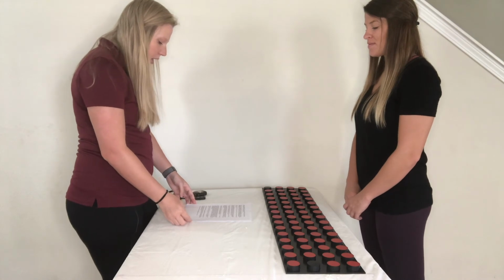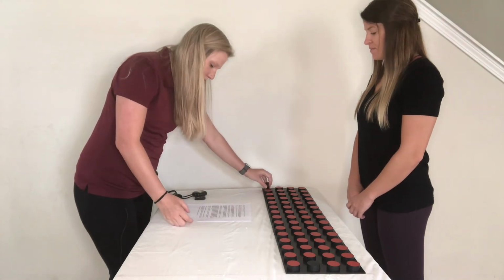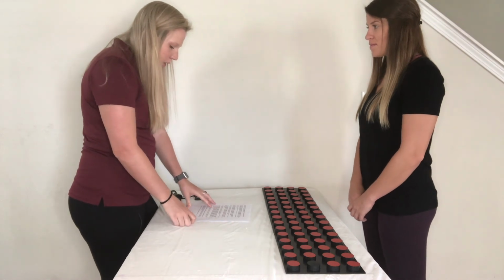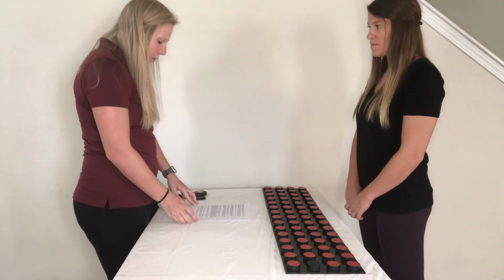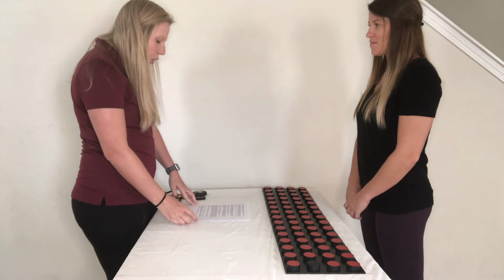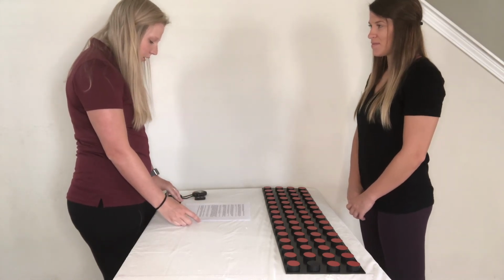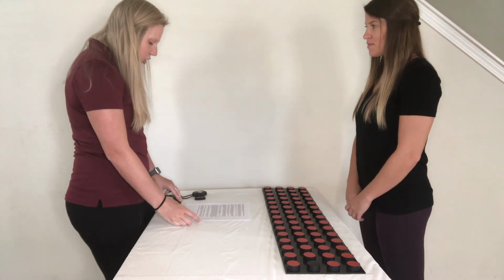You must make sure that all of the discs are fully inserted into the holes of the board before the trial is complete. If you dropped a disc, you must pick it up and insert it into the proper hole before the time is stopped. Your score will be the total number of seconds it takes to complete several trials. We will record the time for each trial separately.